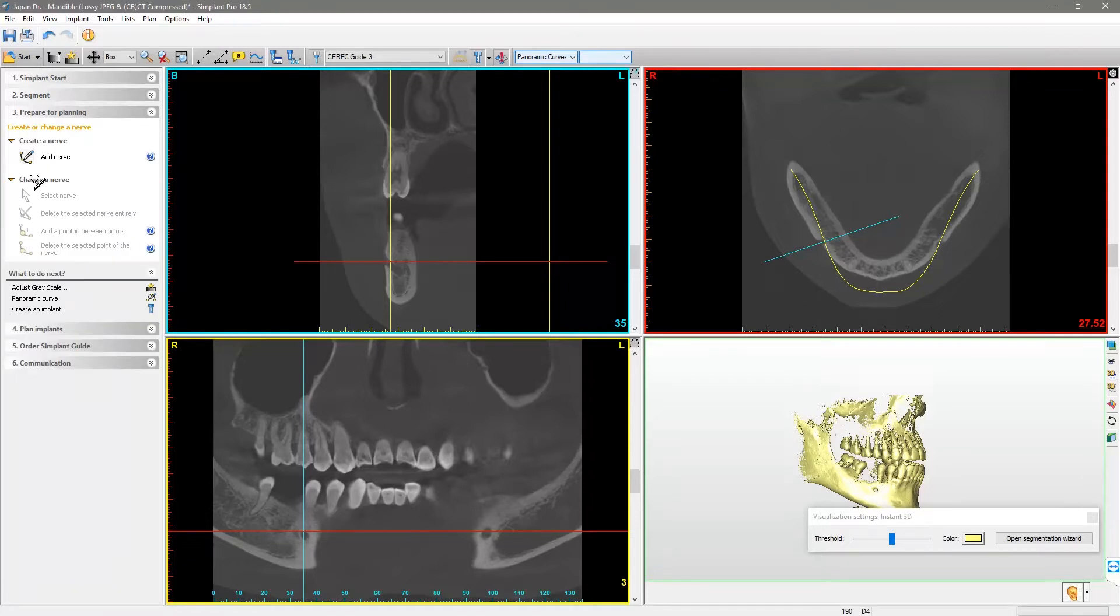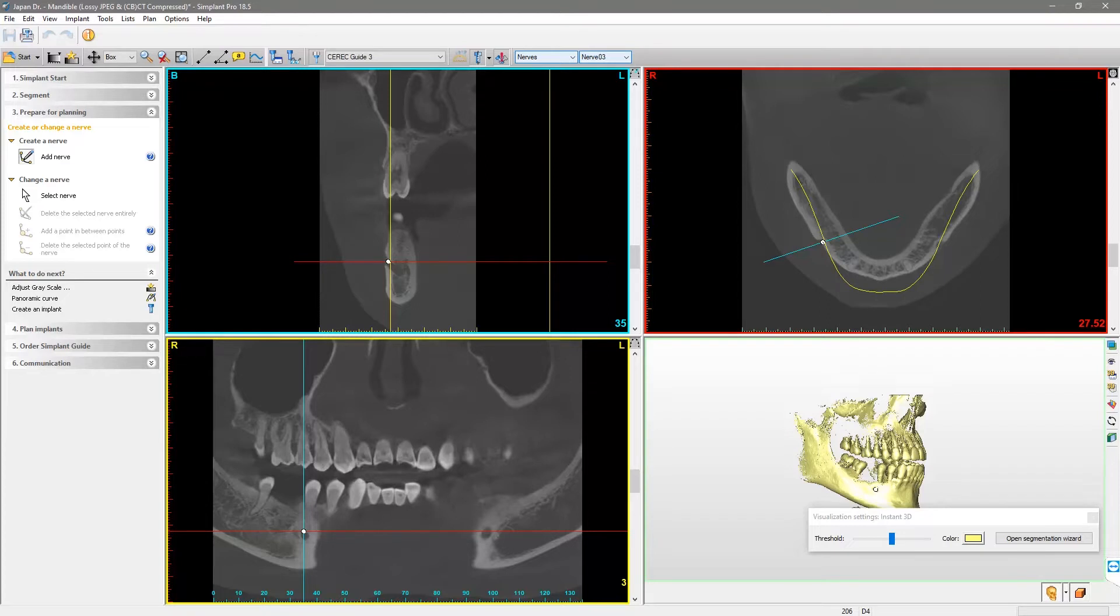In the axial view, we place the first point by left-clicking in the center of the foramen mandibulae. Scroll through the axial view and add additional points by left-clicking in the center of the visible nerve canal.